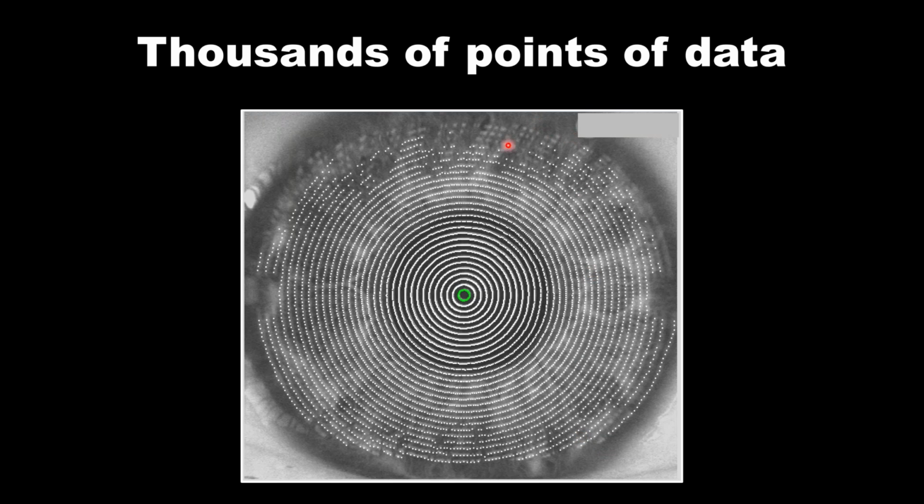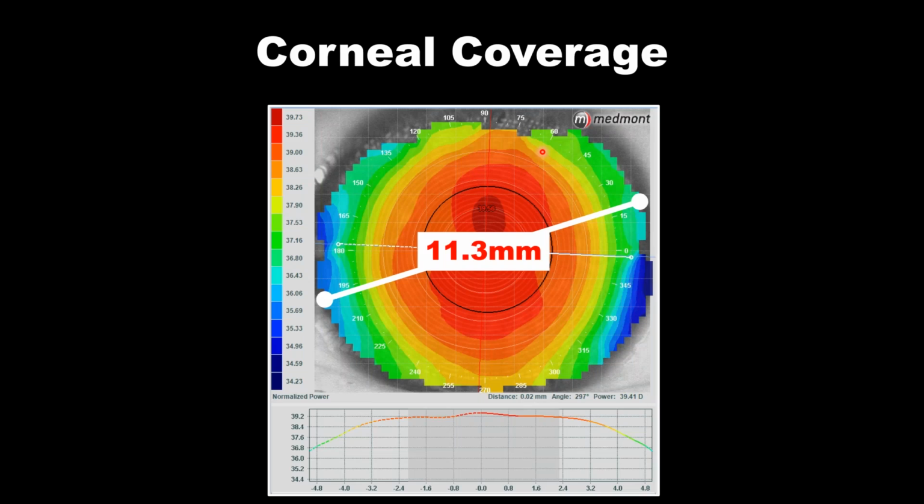You'll notice up here where the eyelash shadows are coming down, we're actually losing a few areas of data, and that's eliminating both the rings and linear sections of the ring as well. So do all you can to open up that fissure, get the lids out of the way, get the eyelashes out of the way, and that's going to help us have as much information as possible.